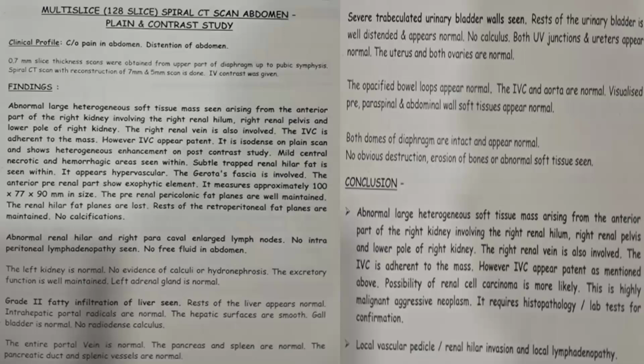Here the renal vein is invaded, they have already given that. The IVC is adherent to the mass and it is patent, like they have given. Adherent, yes, sir. So is there any role of IVC MRI? Yes, sir, we can do MRI to know the level of thrombus in this patient. MRI for the level of thrombus or for the infiltration? Wall invasion we can do, sir. If it is not clearly seen in the CT, we can do MRI to know the level of involvement.